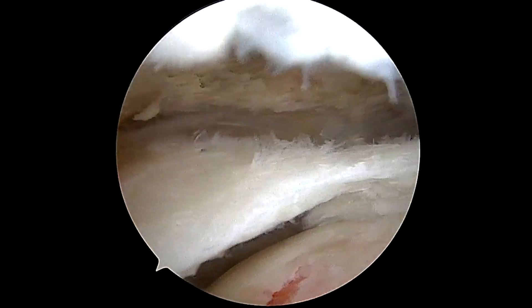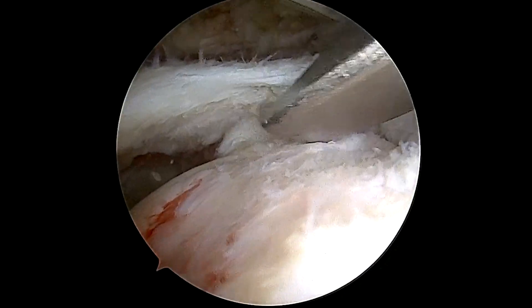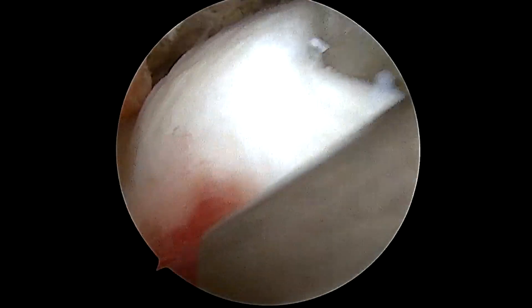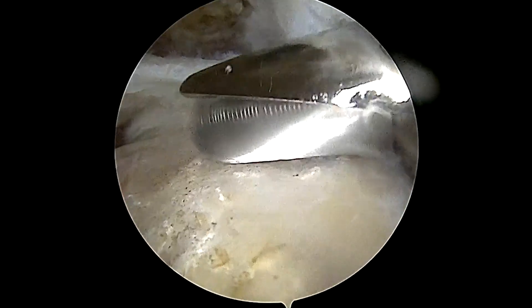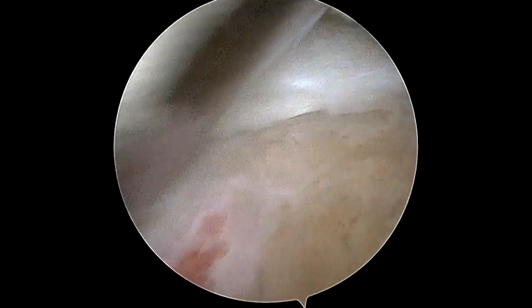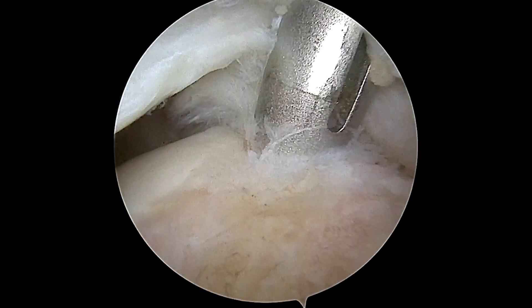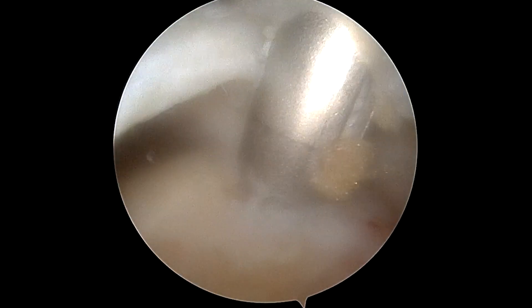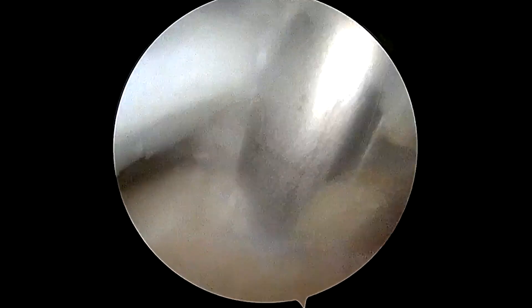The shaver is introduced again to debride tissue in the way and clean it up so we get a better view of the rotator cuff. We can check for excursion and mobility of the tendon to see how mobile it is and which way the tendon is torn, to determine how we want to pull it for the repair. The burr is used again to perform what's called a tuberoplasty — we take down a very thin layer of bone to allow marrow elements to come into the repair area and promote healing. From here, we introduce a guide through a tiny poke-hole incision in the skin. This guide is cannulated, allowing us to put an all-suture anchor through it directly into the bone — not very traumatic, very small, low-profile anchor.